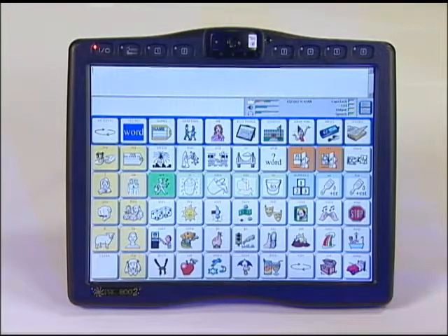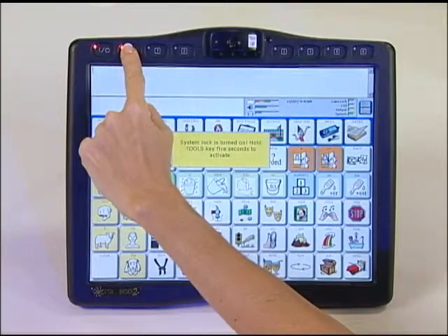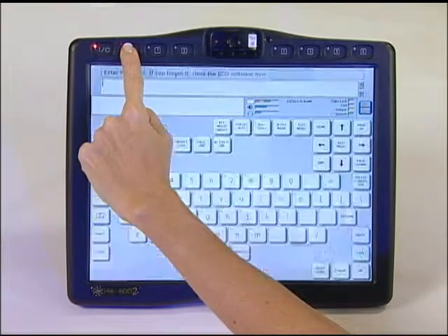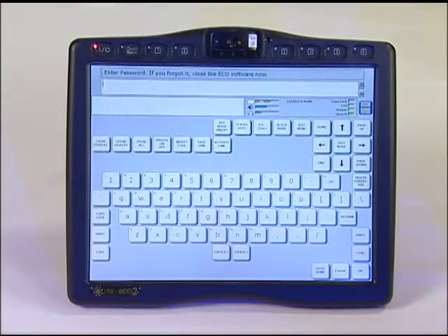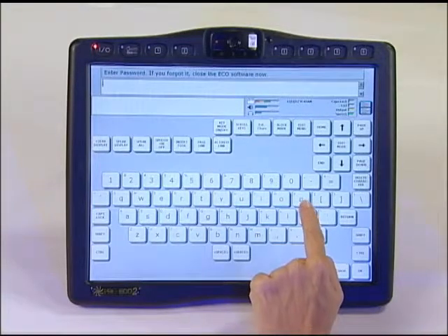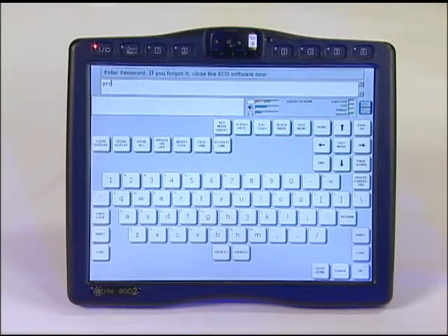To unlock the system with a password, press and hold down the toolbox key for 5 seconds or until you see the gray password screen. Once the password screen appears, enter your password. In this example, the password is PRC. Then select OK.